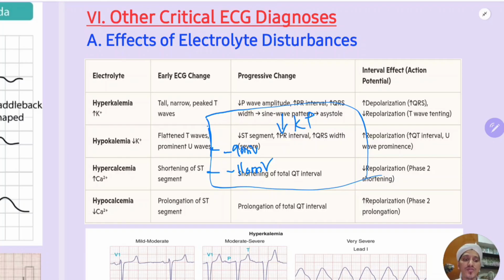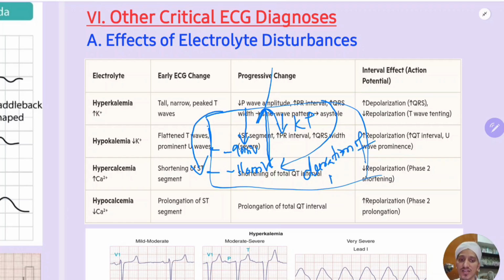So it seems the cell will be difficult to depolarize. The cell will need more impulse to depolarize, but the book says that the effect will be more on the repolarization. If you want to bring -110 to the more positive side, you will require more impulse, but the book says the effect will be more on the repolarization. So -90 will be early to repolarize, but if you go further negative, then the duration of repolarization is prolonged.